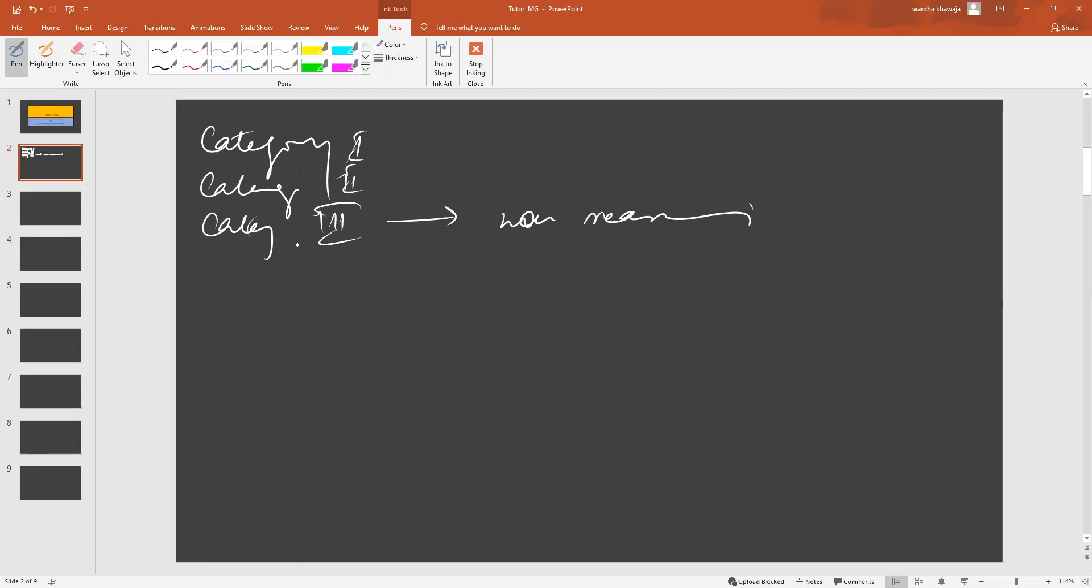Now, with the category 3 tracing, what we actually end up seeing, or what we consider, is basically the absence of variability. Variability is when the fetal heart rate varies from 5 to 25 beats per minute, and this is represented in the tremulousness of the tracing.